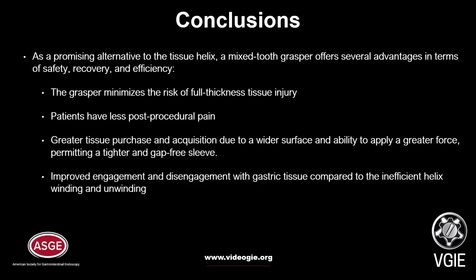As a promising alternative to the tissue helix, a mixed-tooth grasper offers several advantages in terms of safety, recovery, and efficiency. The grasper minimizes the risk of full-thickness tissue injury and patients have less post-procedural pain. Greater tissue purchase and acquisition is achieved due to a wider surface and ability to apply greater force, permitting a tighter and gap-free sleeve. Improved engagement and disengagement with gastric tissue compared to the inefficient helix winding and unwinding.